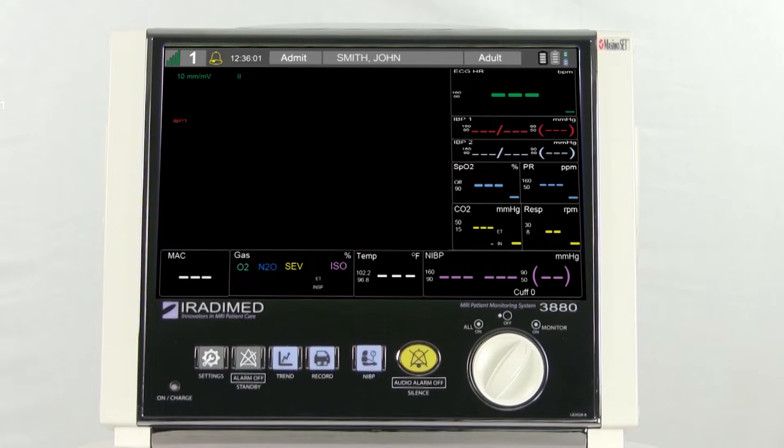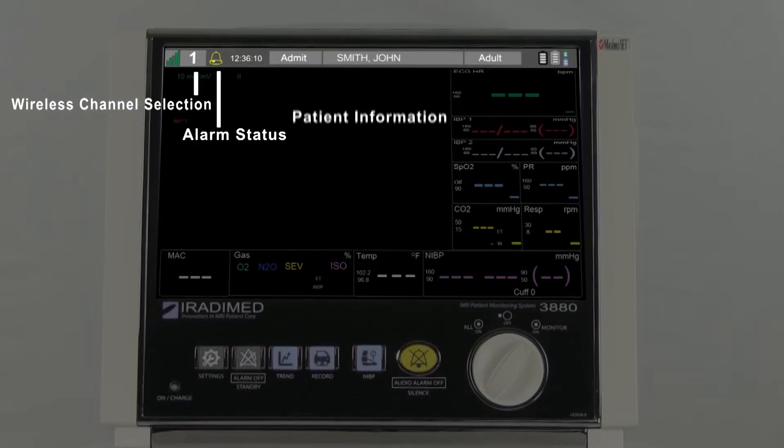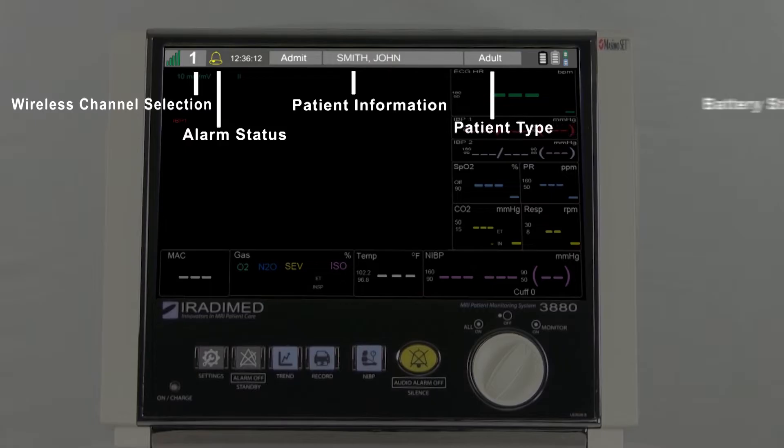The patient monitor display has been broken into several color-coded sections. At the top of the monitor, the user will see the wireless channel selection, alarm statuses, patient information, patient type, and battery statuses.